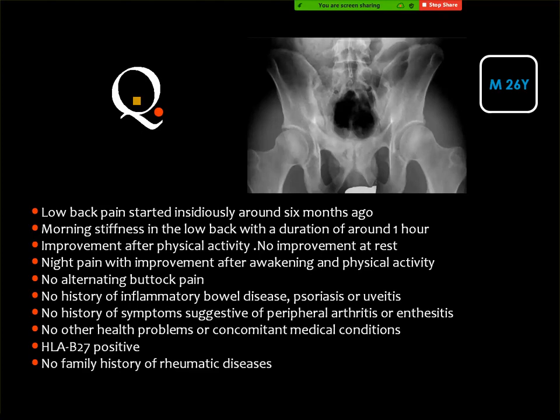Yes. Okay. This history is almost a classic for the recent topic known as axial spondyloarthropathy, and I hope that you have heard this lecture.